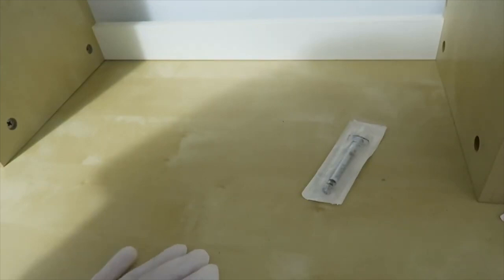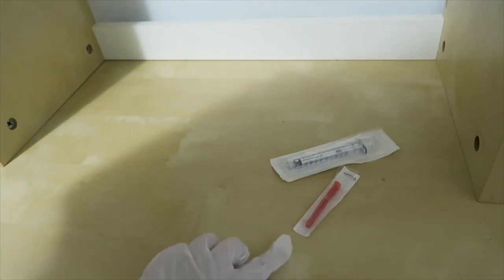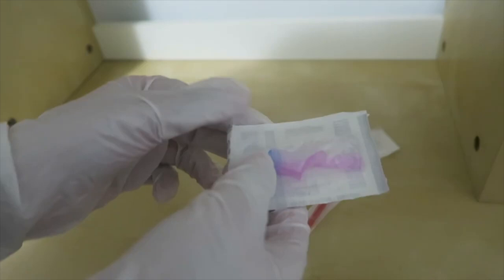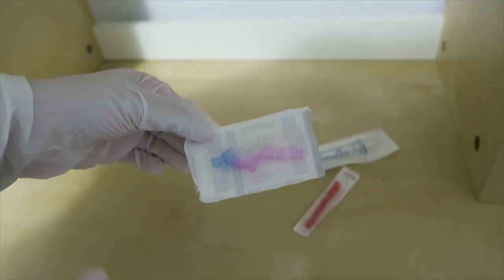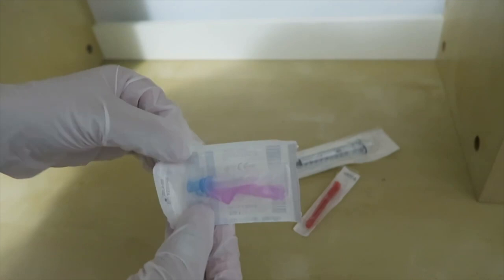So today, because we are administering 1ml of vitamin B12, I've chosen my 1ml syringe. I also have my blunt fill needle, which will be used to draw up the medication. And I have chosen my 23 gauge and 1 inch needle to administer this medication. And the reason I've done this is because the medication is not too viscous. So the 23 gauge will be perfect.